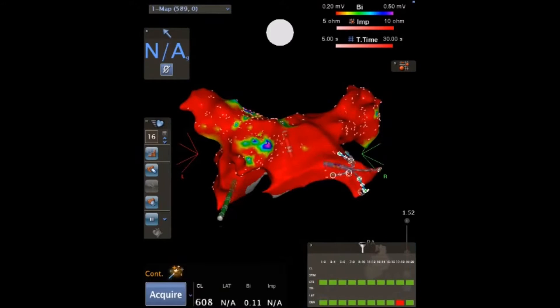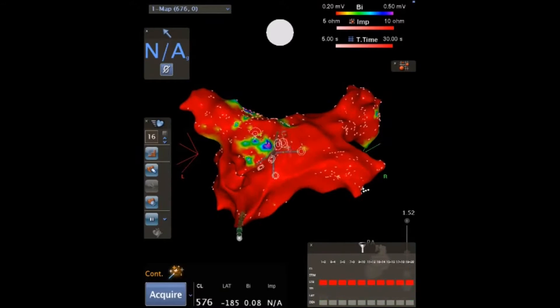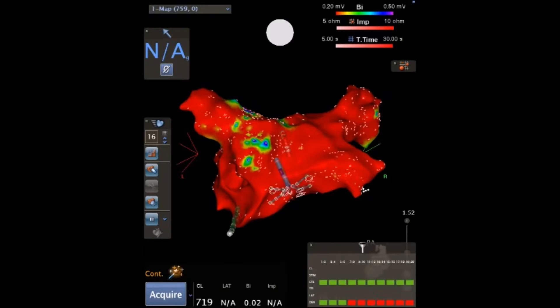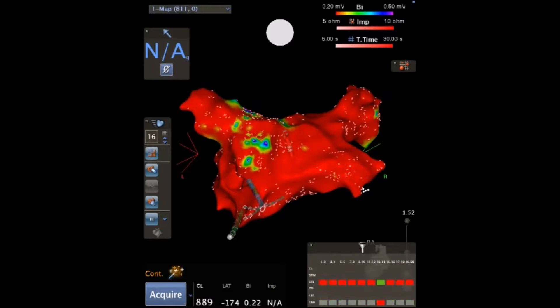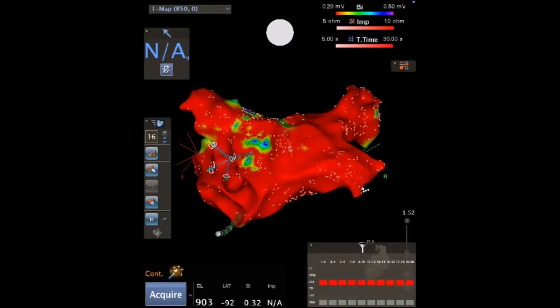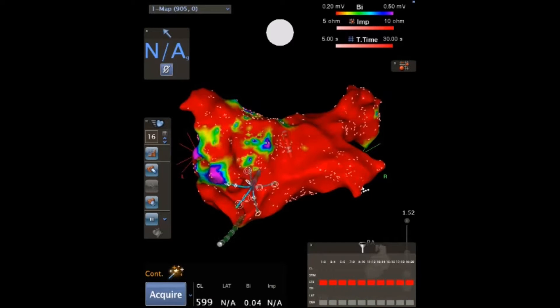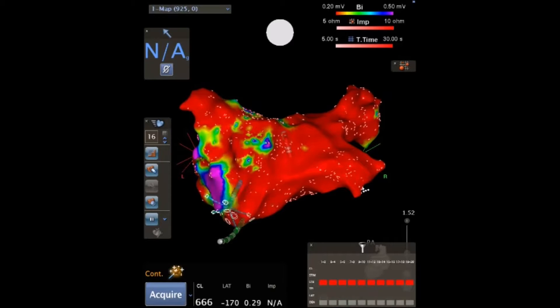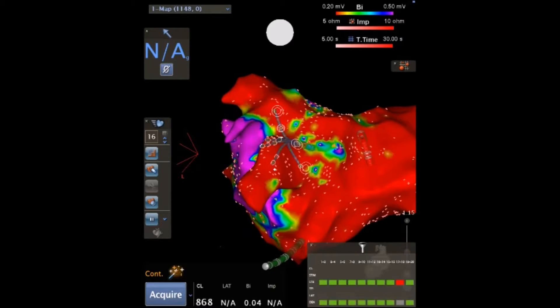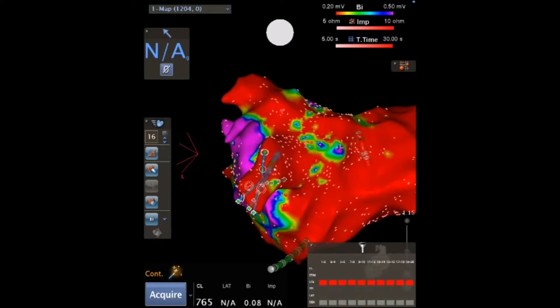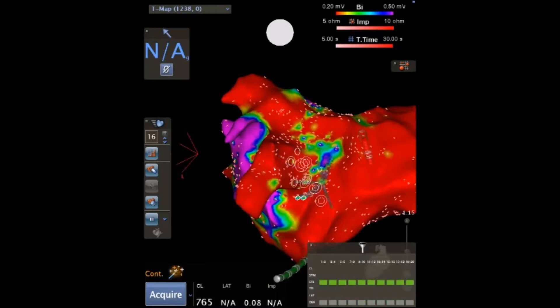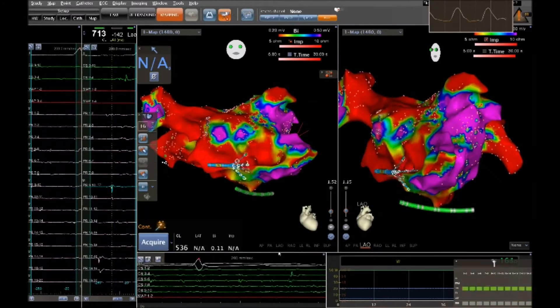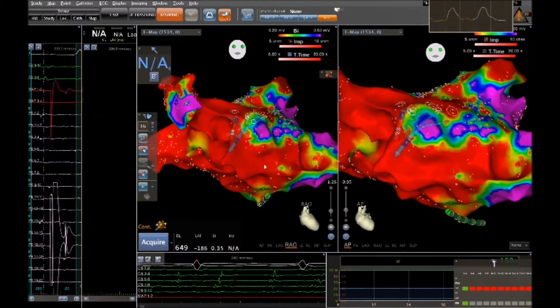With a multipolar catheter inside the heart, an electrophysiologist first creates a 3D geometric model of the left atrium. Different colors represent the normal and abnormal electrical signals that cause atrial fibrillation.